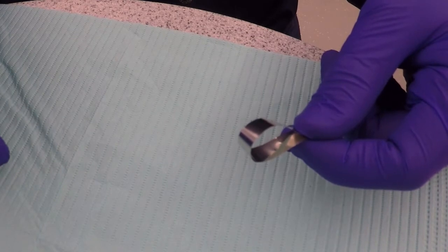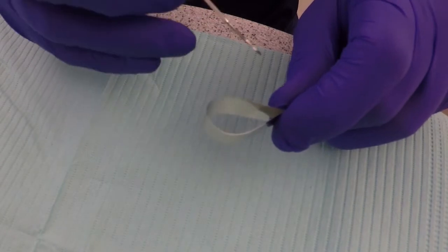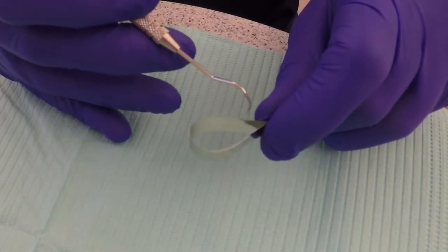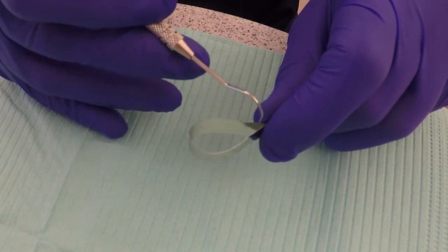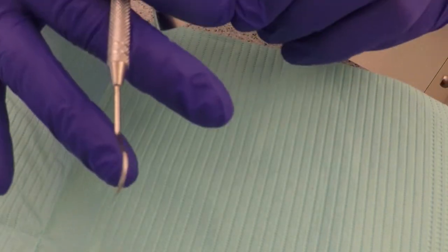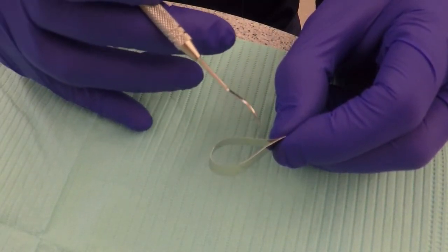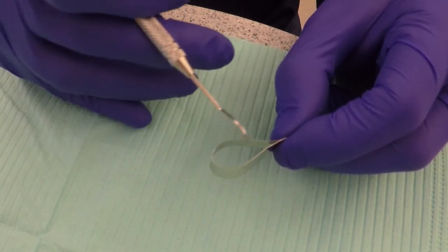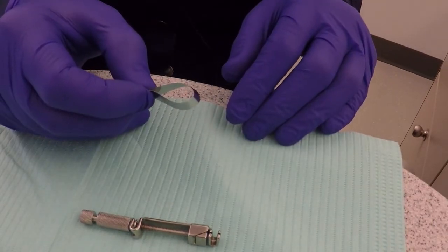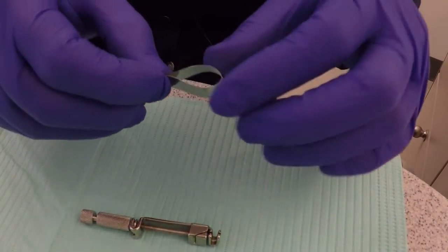Identify the occlusal and gingival aspects of the matrix band and bring the ends of the band together to form a loop. The larger of the two circumferences will be placed toward the occlusal. The smaller circumference will be placed toward the gingiva. Place the occlusal edge of the band into the retainer first and then guide the band between the correct guide slots.